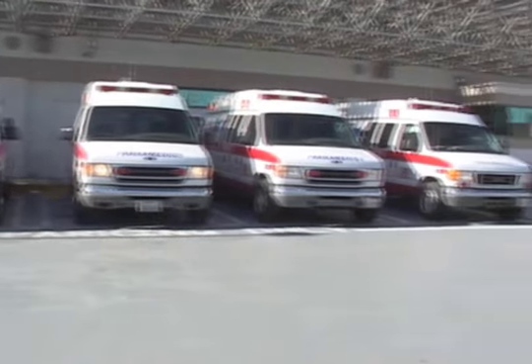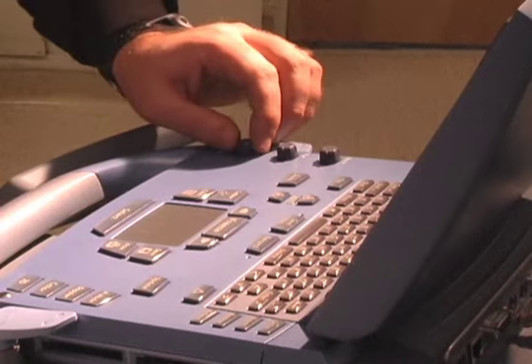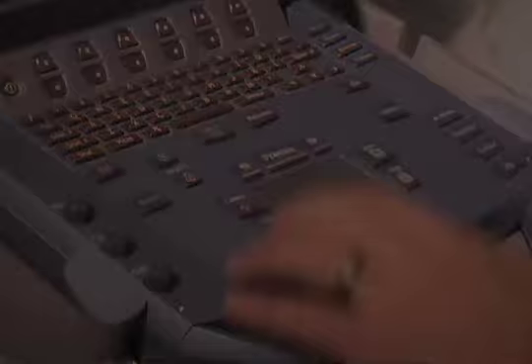Welcome to Mobile Medical Media's video tutorial on ultrasound evaluation of the aorta. This tutorial teaches you to identify the aorta and abdominal aortic aneurysms.